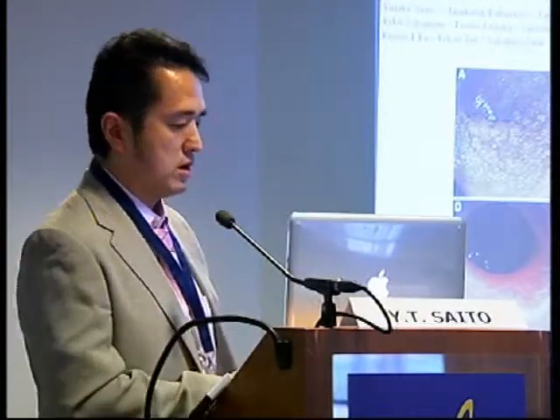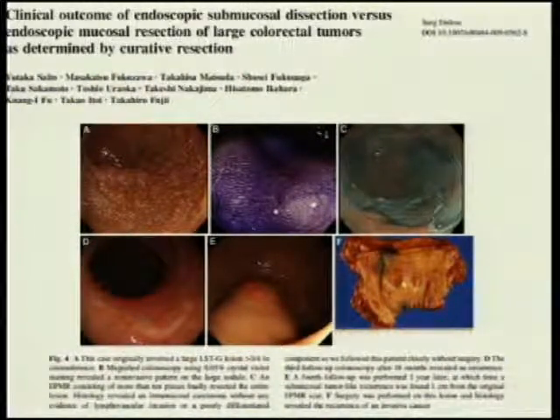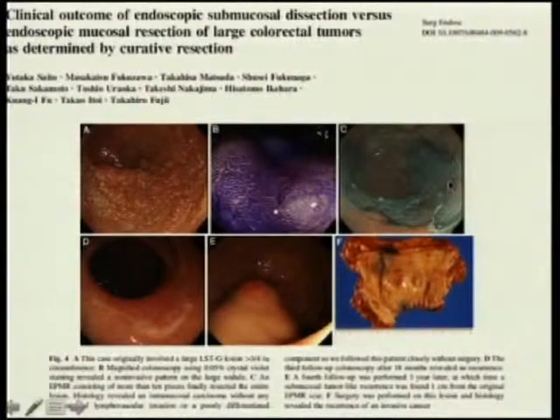Quite recently, we experienced this kind of case. LST granular, more than 5 centimeters. Magnification endoscopy showed a non-invasive pattern. More than 8 years ago, I performed planned piecemeal resection, and histology revealed intramucosal cancer without lymphovascular invasion at this moment.